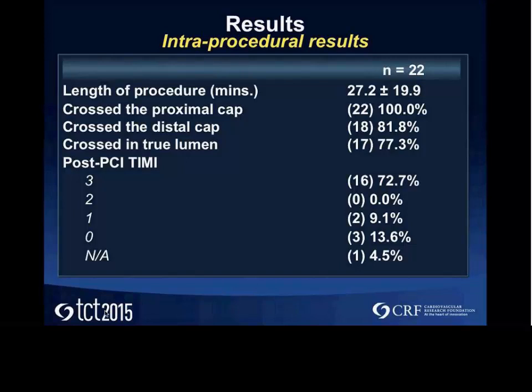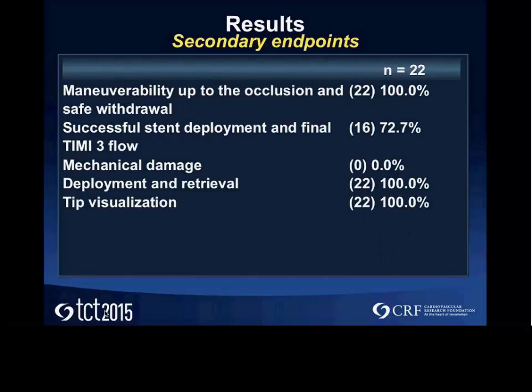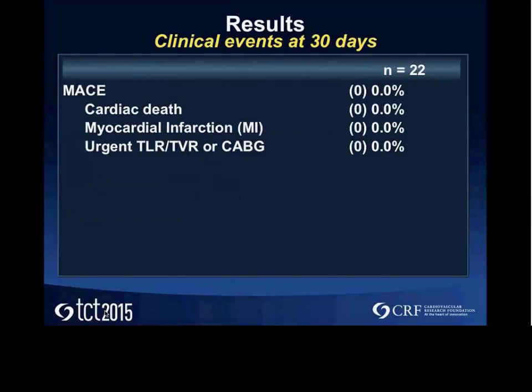So I think for those repeated procedures and high J-CTO score, it's not a bad result. And the maneuverability of the occlusion with the device and safe withdrawal and successful stent deployment was obtained in the same number of the patients. There was no mechanical damage and good tip visualization, so no MACE.